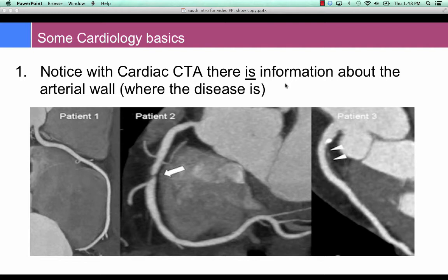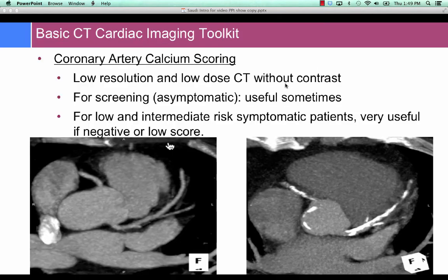And I would like to predict that as we are able to image these plaques non-invasively with better and better resolution, and learn more about biomarkers that perhaps accompany and reflect the manifestation of an unstable plaque in the blood milieu, I have a feeling that we will begin to put in stents, perhaps some of these biodegradable stents which are coming along soon, and we will begin to stent plaques that have a high likelihood of becoming a dangerous plaque, particularly if it's in a proximal portion of an important vessel like this one is.